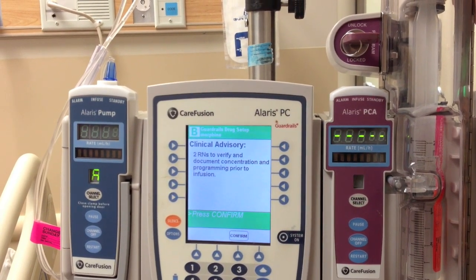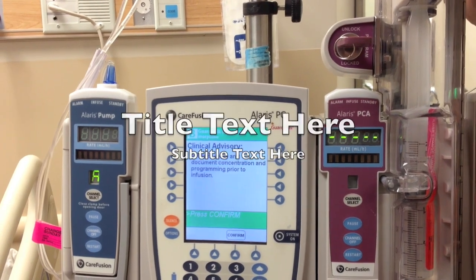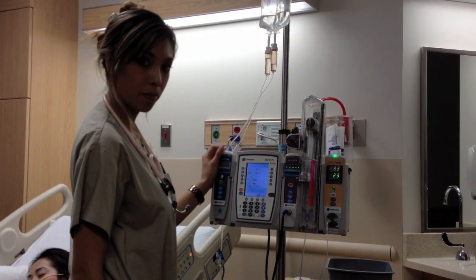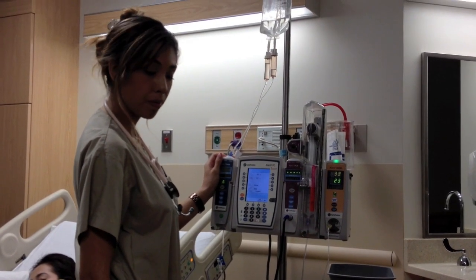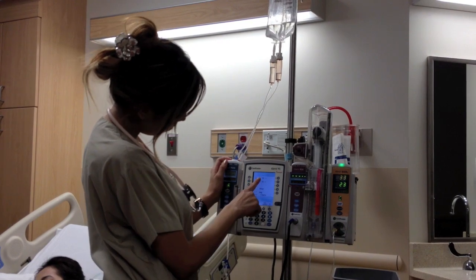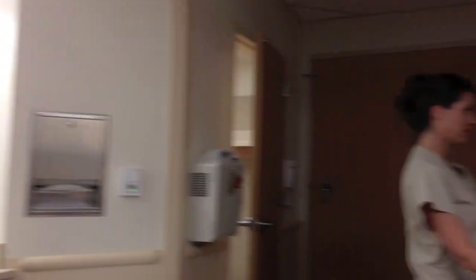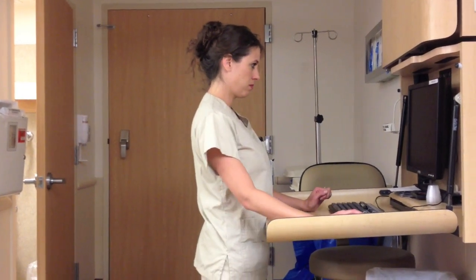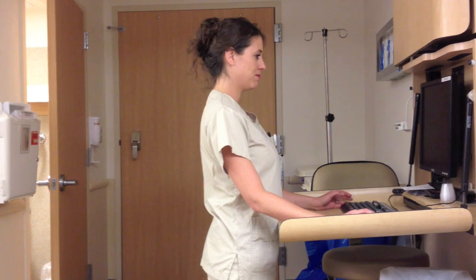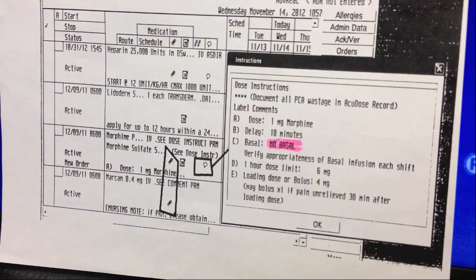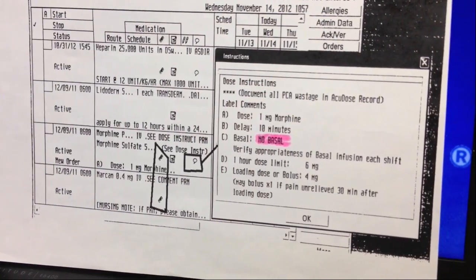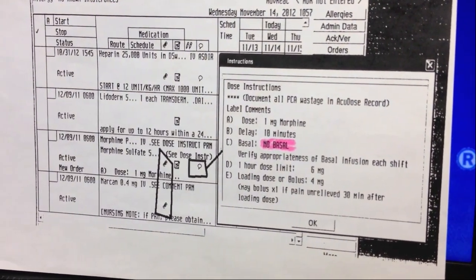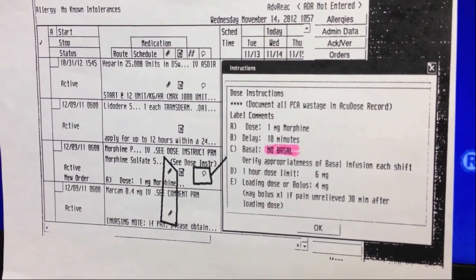Now it is time for the two RNs to verify the dose with the EMAR. While the primary nurse reads off the dose on the infusion pump, have the secondary nurse pull up the medical record. When verifying the order, make sure to take note of the conversation bubble located on the medication record.